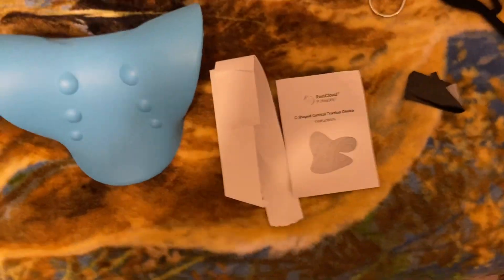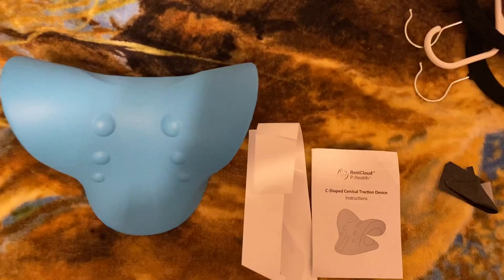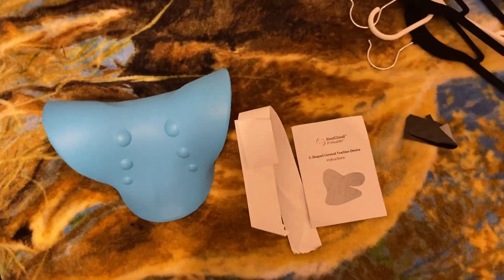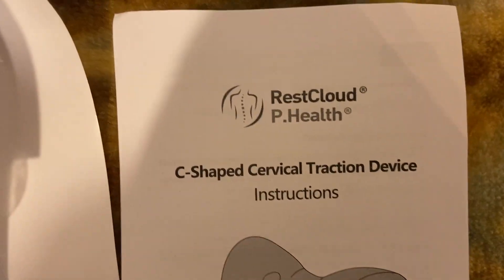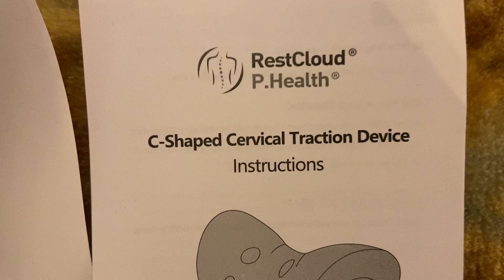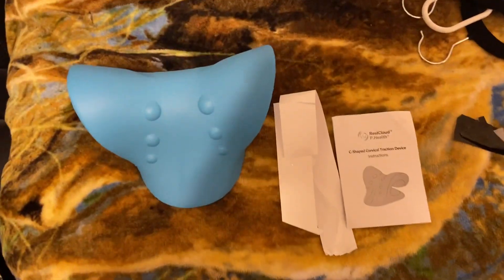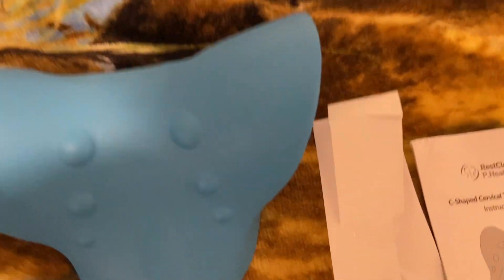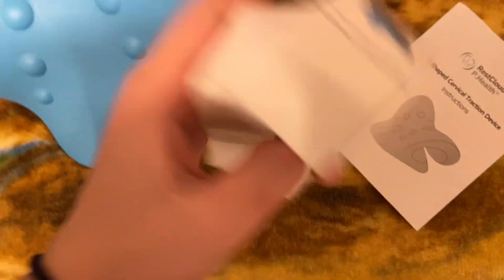What's going on guys, I thought I'd make this real quick product review video for Amazon. This is the Rest Cloud P Health C-shaped cervical traction device. Here's what you will receive in the package.